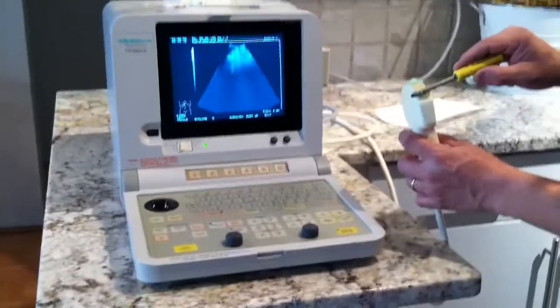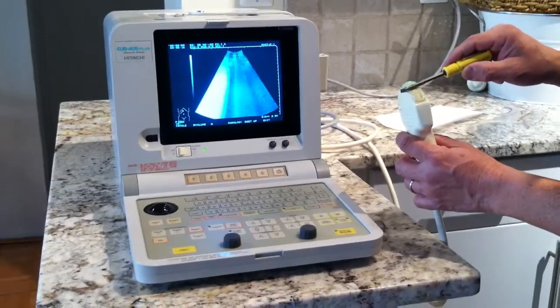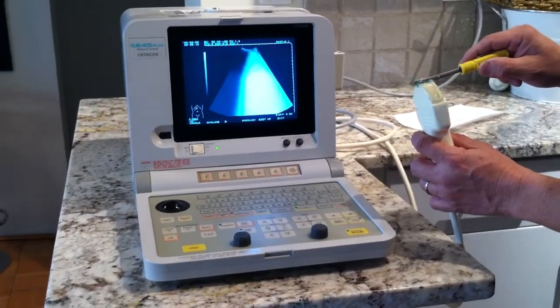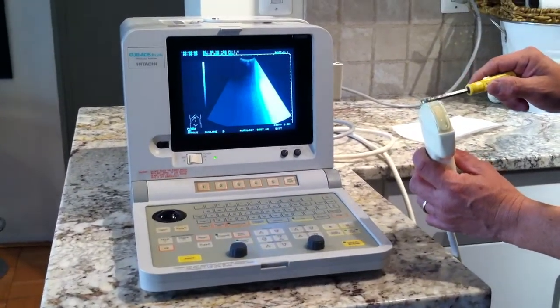If there are any dropouts, it would show on the screen. Look — it's all white. All white across the entire image. Still nothing, nothing, nothing. See? No dropouts detected.